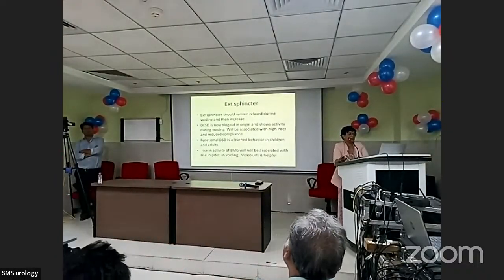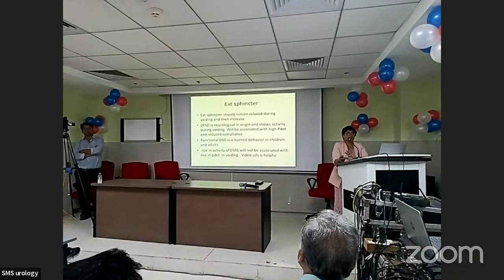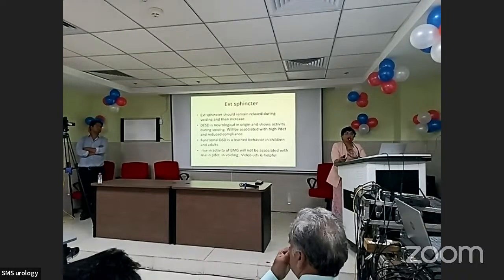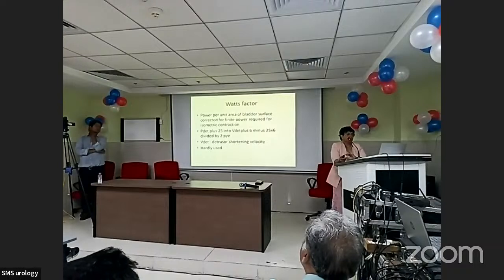Usually, functional DSD is a learned behavior in children and adults. It's otherwise usually due to a neurological cause. And in this situation video urodynamics will be useful because it will tell you the level at which the obstruction is occurring.